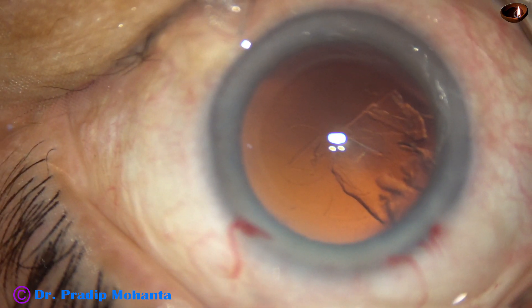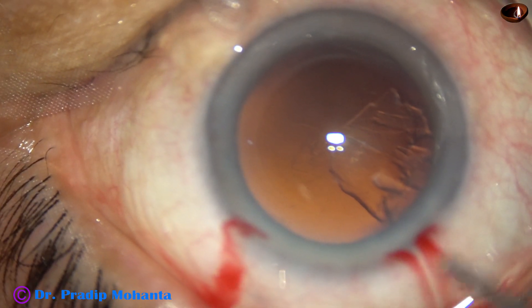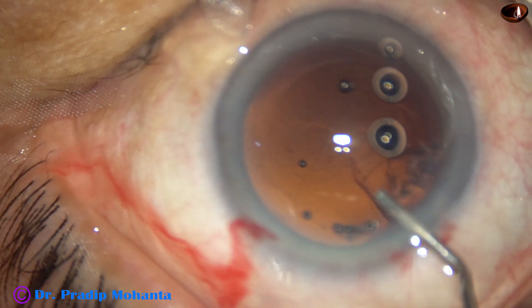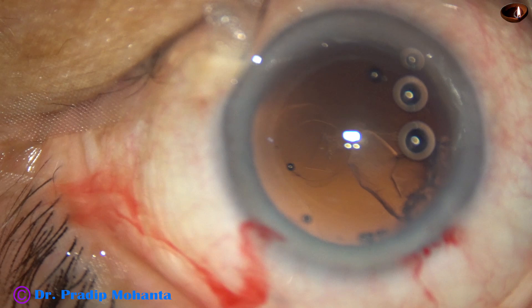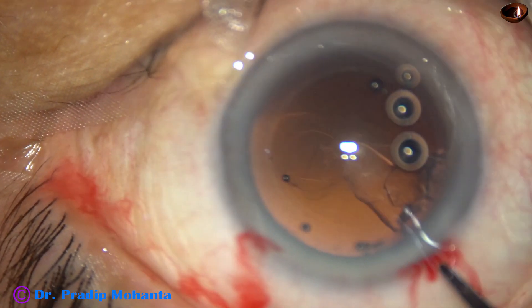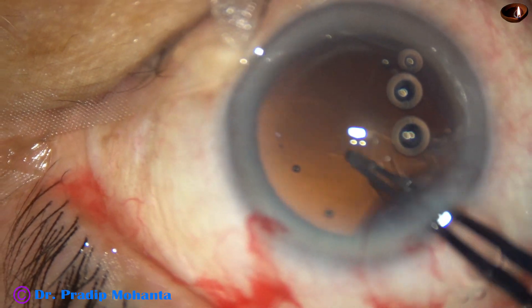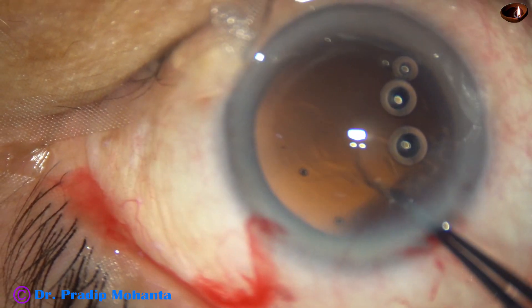My plan is to convert this rent into a posterior rhexis. I inject 2% hydroxypropyl methylcellulose. I can see the tag very clearly. I take the utrata forceps, hold this tag, and convert this rent into a posterior rhexis.